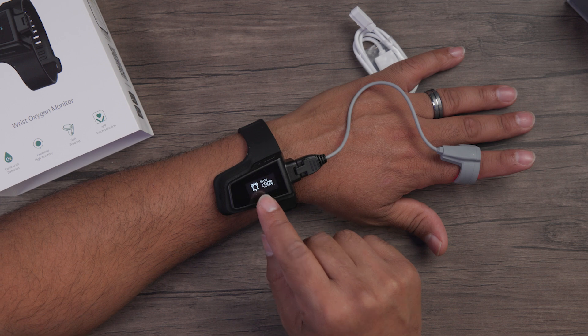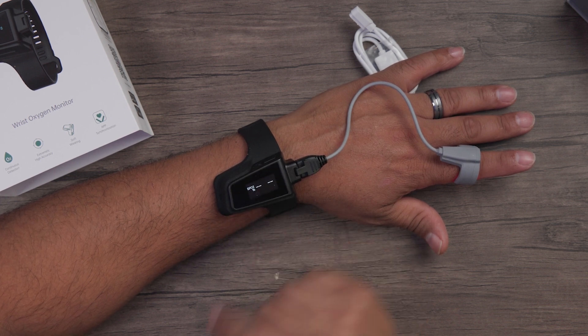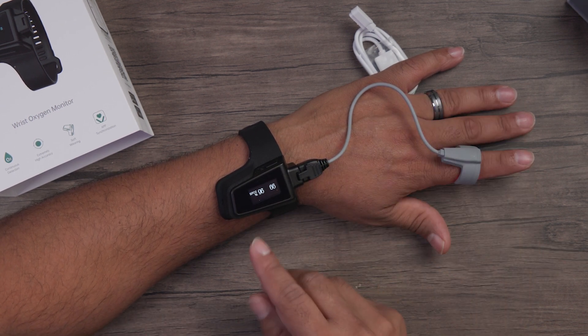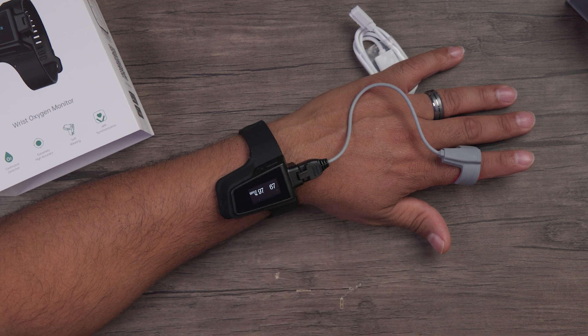Automatically, you'll see that the wrist device is set to vibrate if our oxygen drops to 90. It's now checking all my vitals — my oxygen and my heart rate. Right now we're at 96 oxygen level and 67 for my heart rate.